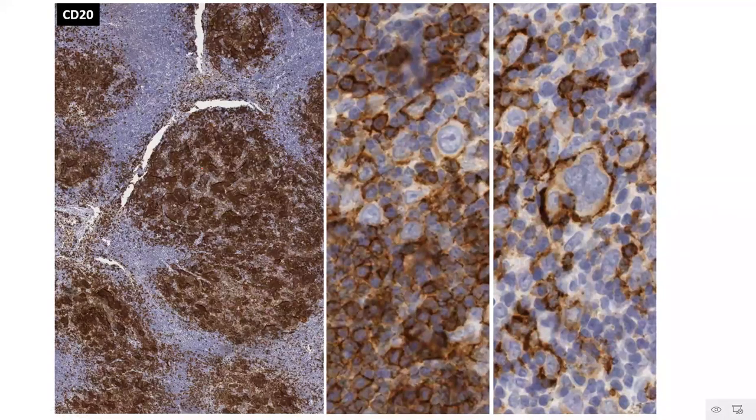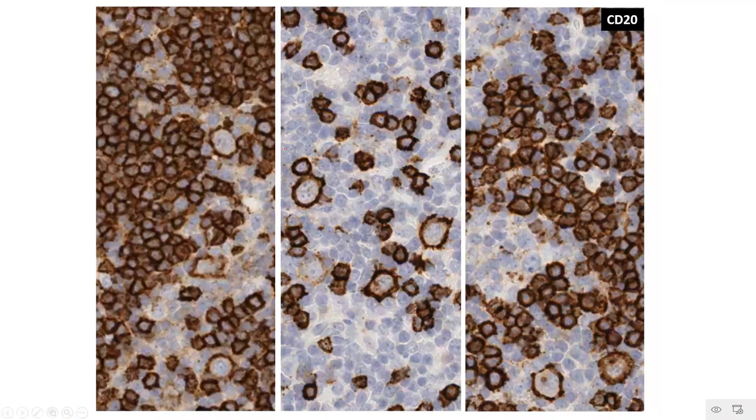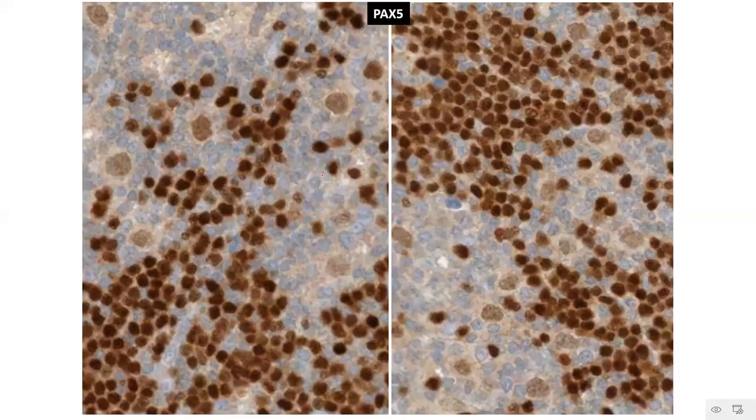On doing CD20, you see that these same nodules are basically picked up as B lymphoid cell rich nodules. And in this particular case, you see that this atypical large cell population is also expressing CD20. Like I said, around 30% of the lymphocyte-rich classical Hodgkin lymphoma can still show membrane positivity for B cell markers like CD20. That does not rule out your diagnosis of a classic lymphocyte-rich Hodgkin lymphoma. Further areas show CD20 positivity in more of these atypical Hodgkin cells.